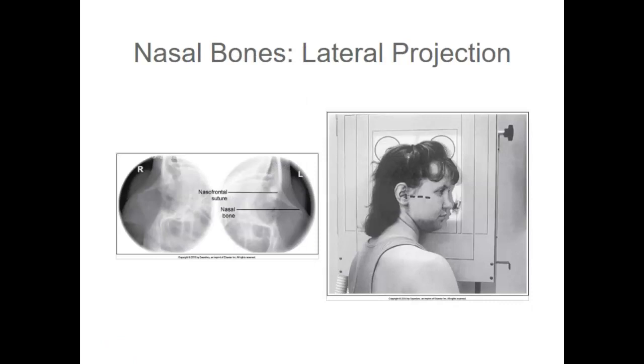Lastly, for nasal bones, we should demonstrate the nasal bones with the surrounding soft tissue. The anterior nasal spine of the maxilla, and the most anterior aspects of the cranial cortices, orbital roofs, and zygomatic bones should be included within the exposure field.